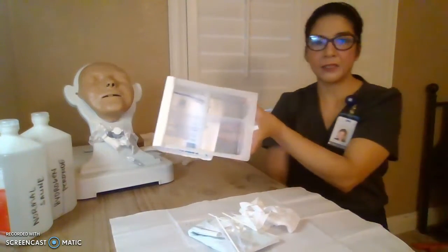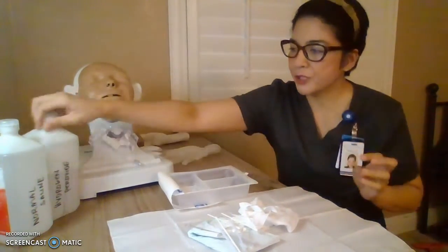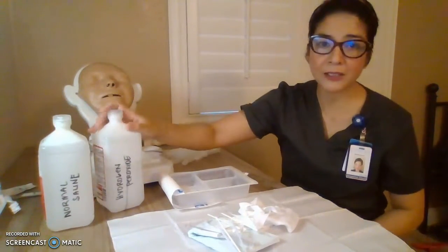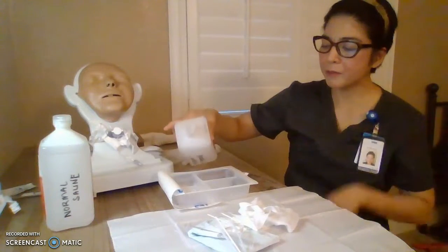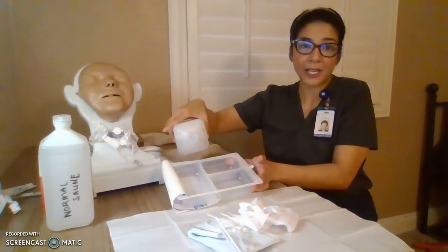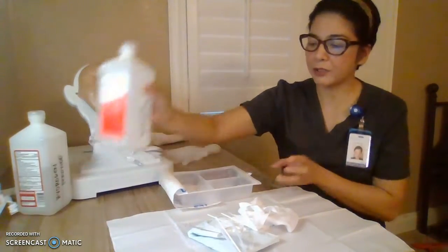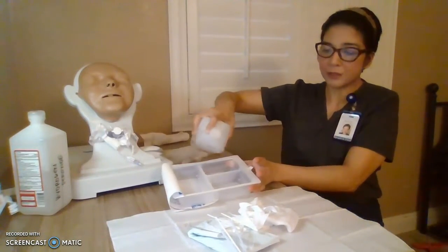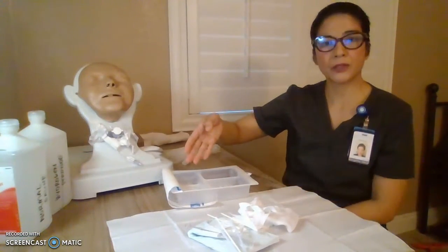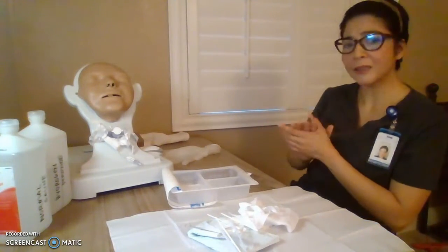All right. And I just want to show you the compartments. So we have our cleaning solution, we have our hydrogen peroxide, and our normal saline. Hydrogen peroxide goes in only one compartment, usually the big one. This is where we'll be cleaning our inner cannula. All right, for the other compartments, all will have normal saline. Okay, so one compartment will have a 50-50 solution for our inner cannula. Okay. So now let's start.